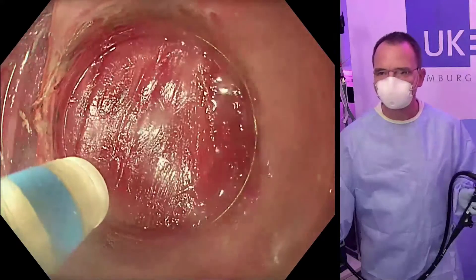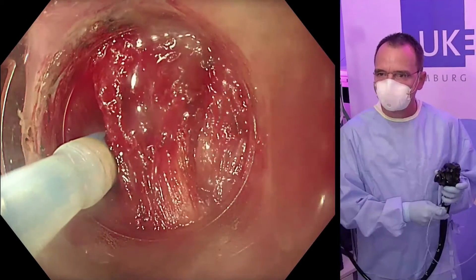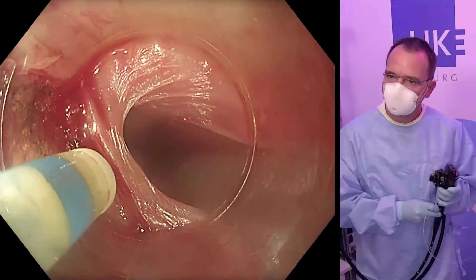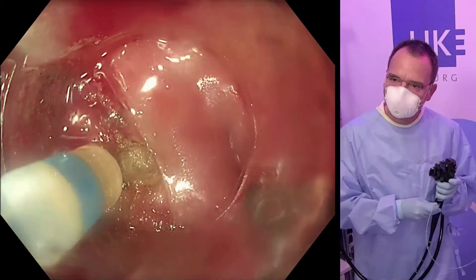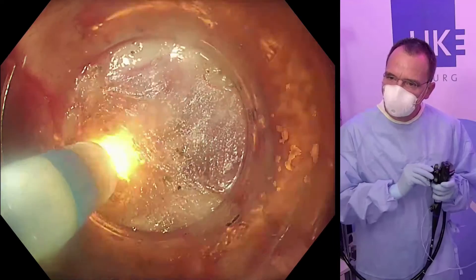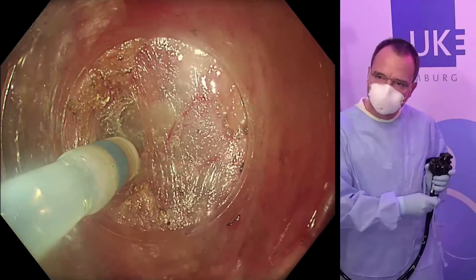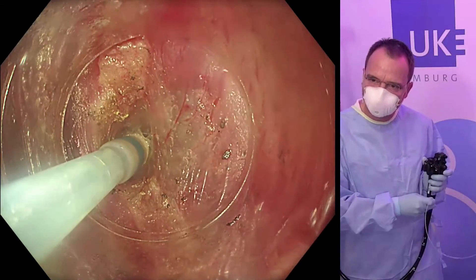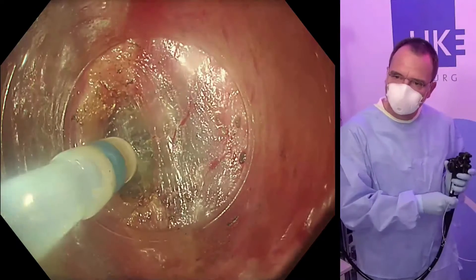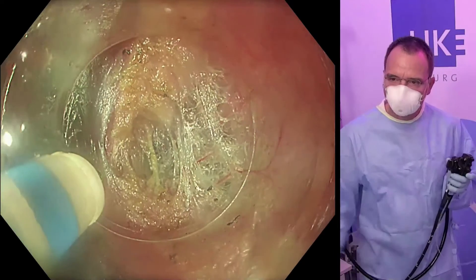The depth of myotomy has not been fully elucidated. We again inject to isolate the muscular layer, and with a special current called twin coag by Erby we continue to dissect. It's not fully clarified how far we should go. We continue injecting and assume that there is an underlying motility disorder which leads to the diverticulum.